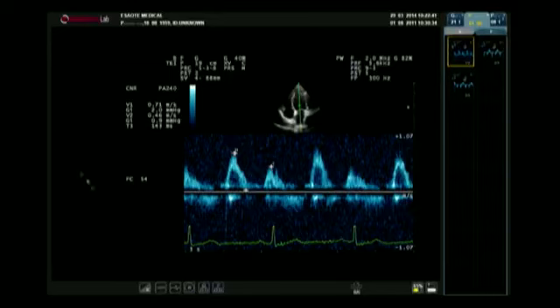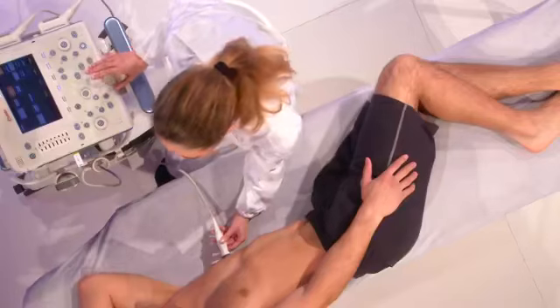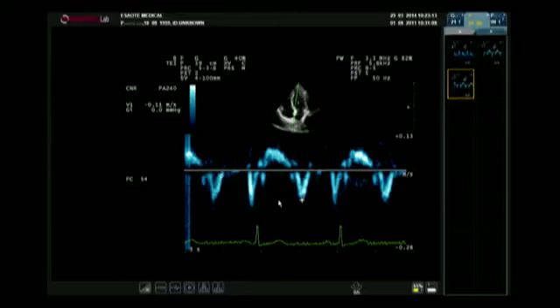Then it's important to give a look to diastolic function. So first by E/A ratio assessment. Then, if it is available on the machine and if you have enough time, by tissue Doppler imaging, you can assess the E/E' ratio. This is very important because a patient with a normal systolic left ventricular function can have acute dyspnea because of a significant diastolic dysfunction.